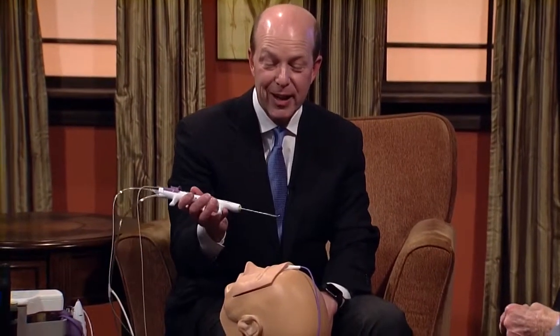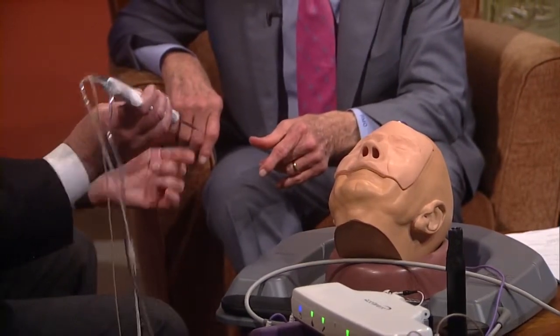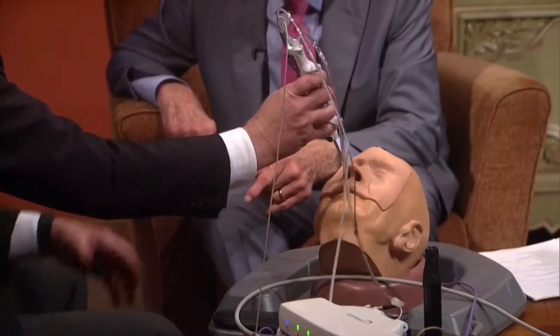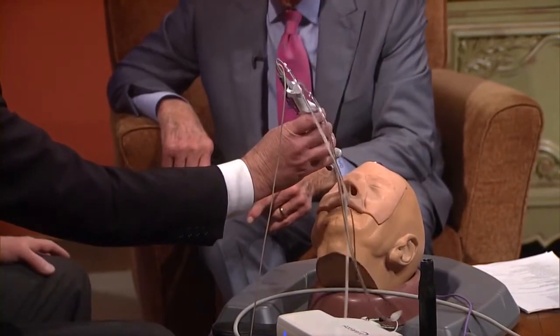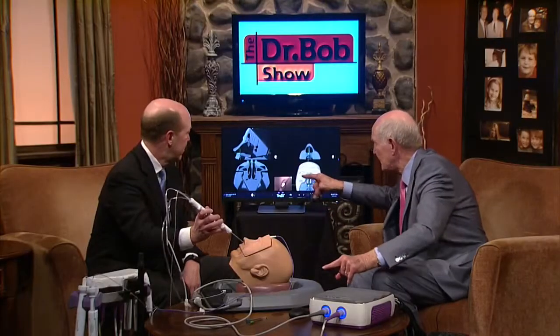We then use the endoscope to look in the nose. Show me the endoscope again. Let's show that up to the camera there. We don't have an endoscope. This is the balloon. But an endoscope would be a rigid camera that would look like this. It would just have a fiber optic into it, and we would stick the camera in the nose, and the camera image would be projected onto a screen, so we would be able to see all the anatomy magnified in front of us. And then we can use the balloon, which has the wire that extends from it. We use our minds and our eyes to guide, but the balloon tip also tells us when we're smart and when we're not. So show me when you put that in the nose, show me what it looks like.